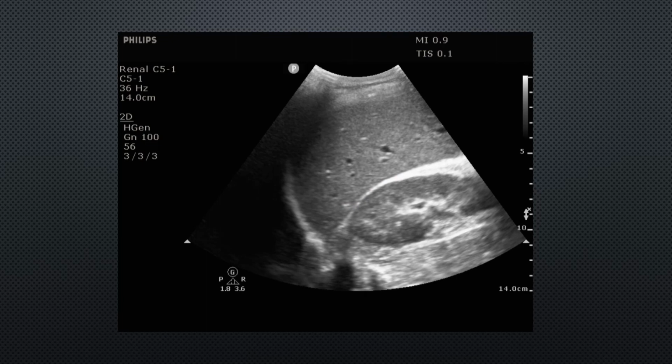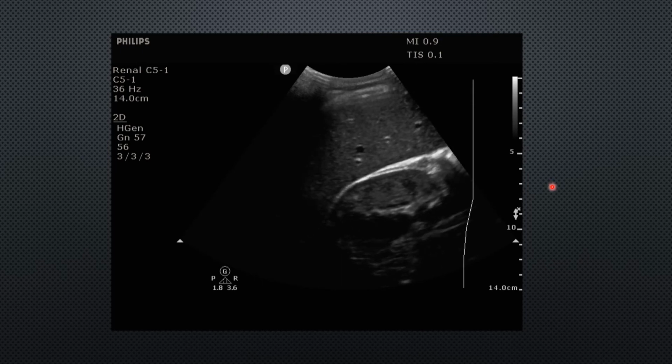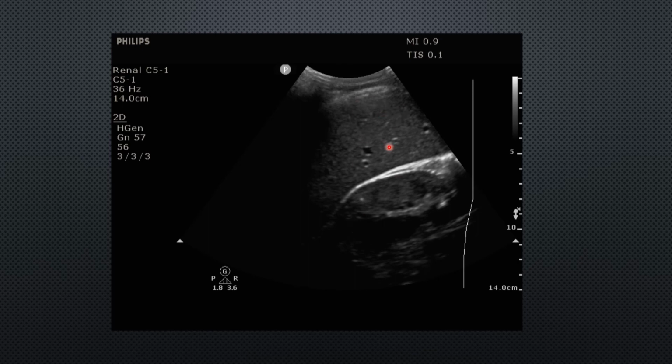So then we crank the gain back down, but someone hits something on the way, and whoops, well, now this is kind of awkward, right? Now this part of the gain looks okay, but this part not so much. The near field and the mid field look pretty good, but the far field doesn't really look as good. It's too dark. So all right, well, go ahead and get that fixed.